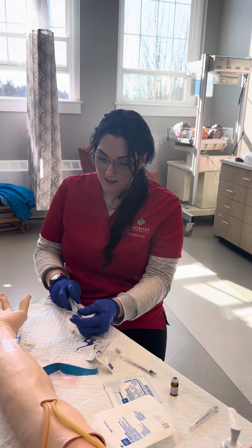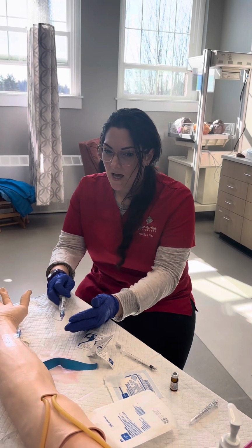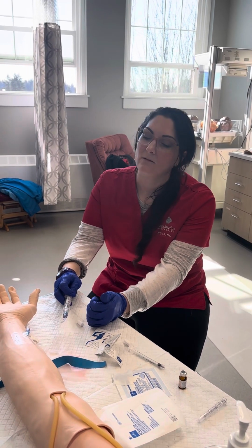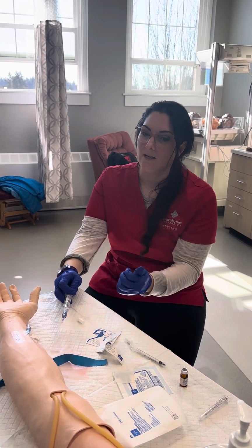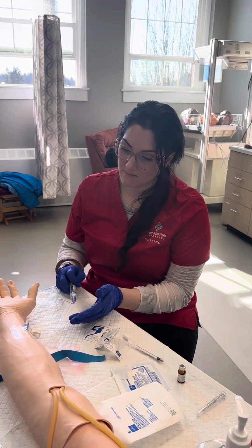And then when I'm giving this, I would make him repeat patient teaching. And then also I would be assessing how he's tolerating the pain medication. And I would also document all this.